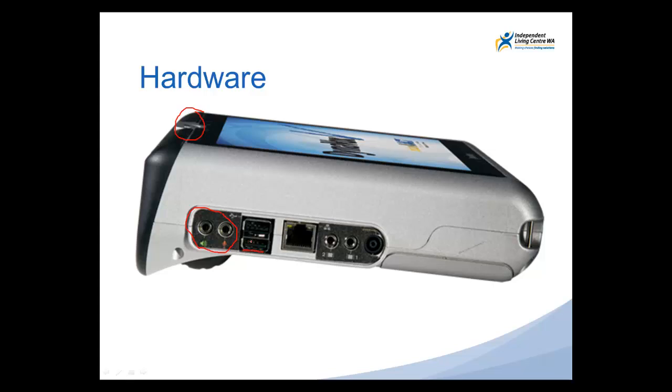Just here you can see a couple of USB ports. They're designed for you to be able to put things into the device. For example, you might wish to upload photos onto particular buttons for communication. It's also used for bringing information out of the device, for example, saving the work and customizations that you've done on the communication pages. Here you've got spots 1 and 2 designed for switches, so if you have a student that's using switch access, that's where the switches go. And lastly, you've got the port for the charger just here.